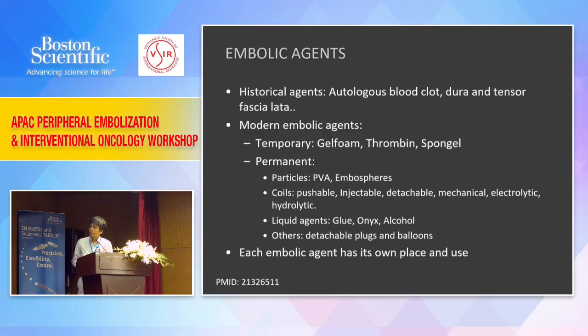Concerning the embolic agent, as we all know, there are two kinds. The less frequently used is a temporary agent like Gelfoam. However, if we don't have Gelfoam in hand, in some cases we have difficulty treating the embolization with a special indication, like the case I showed you, when we only need temporary embolization, and after that it dissolves and lets the vessel recanalize.